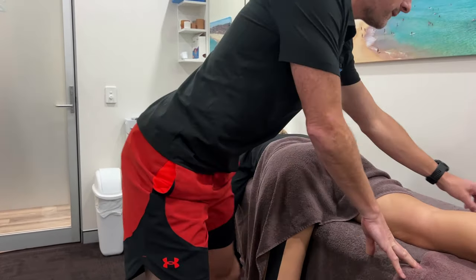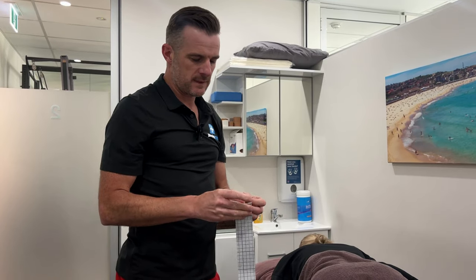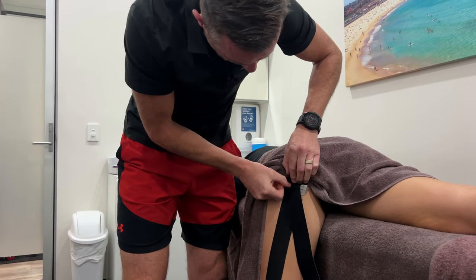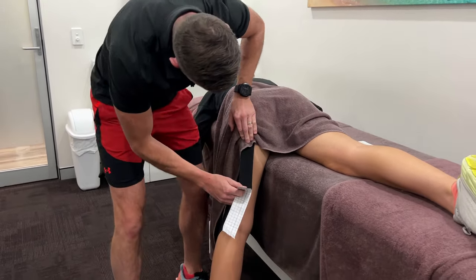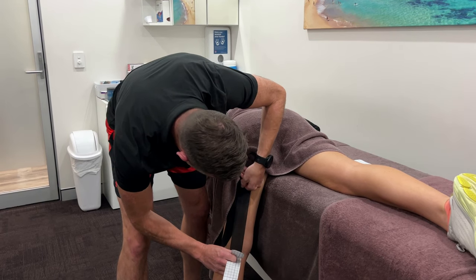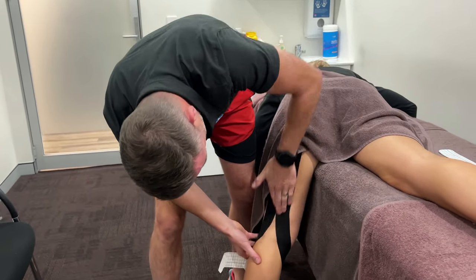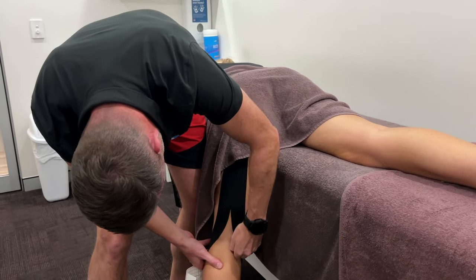Then you're going to work on your next one. I'd say go midline first and then medial second. Find that attachment point, and I'd overlay it a little bit. Pull it out, make sure that's really pushed down, and then stretch it out going down the midline. You can go down the midline and then over medially, right round onto the attachment point on the tibia. Really push that down. Lots of heat into that — see where all the bits pop up and try to push those all down.